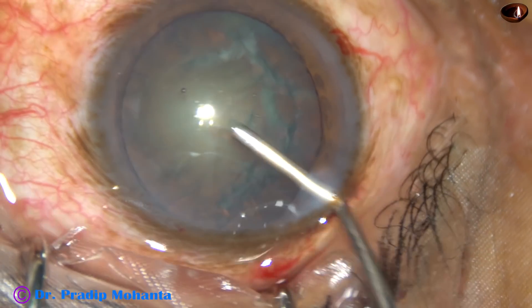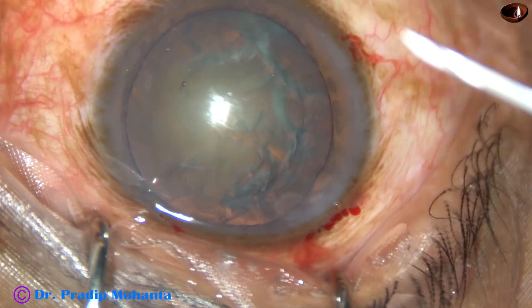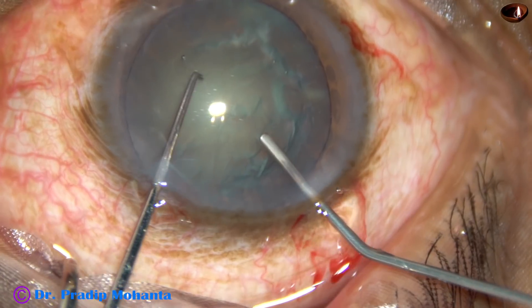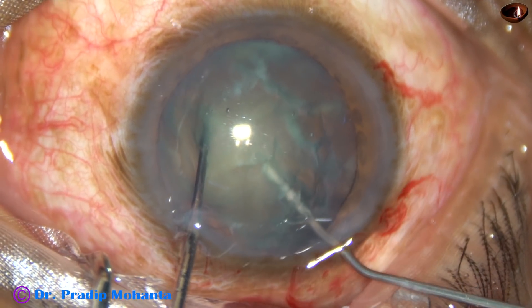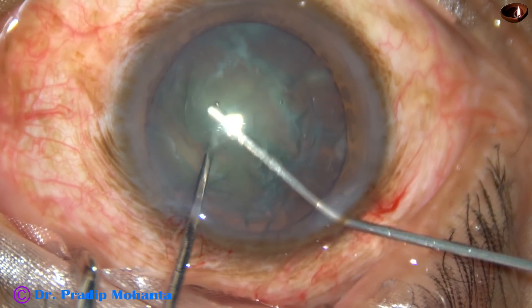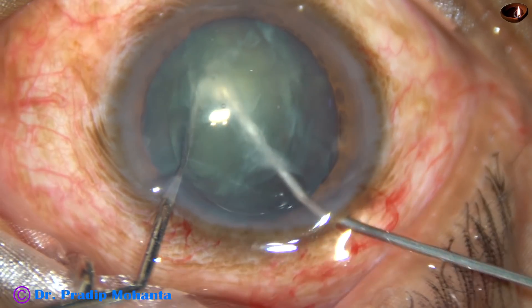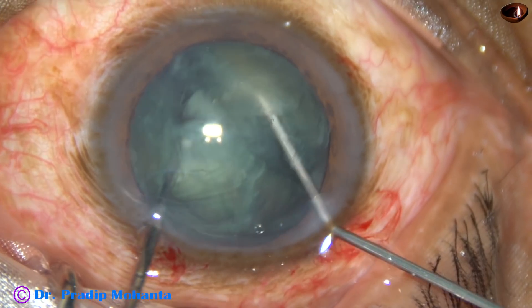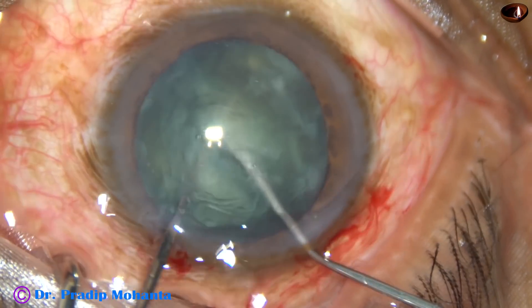Visco — 2% HPMC — is injected. The chopper is taken in the left hand and goes in fast. Both instruments come towards each other, and by lateral forces the nucleus is divided into two halves.